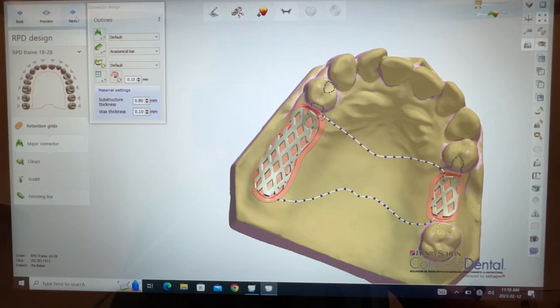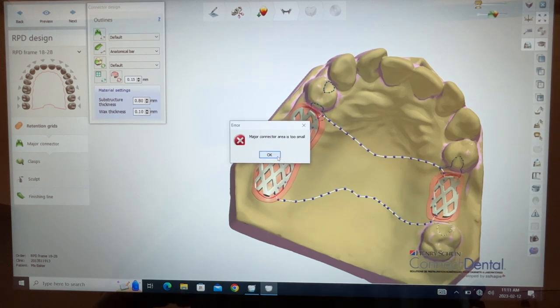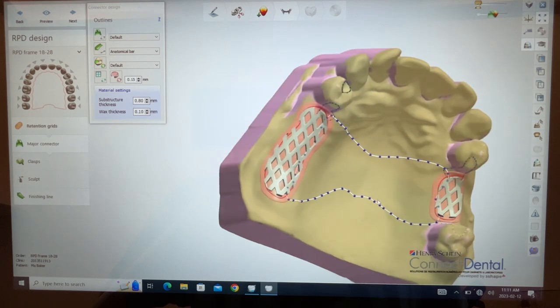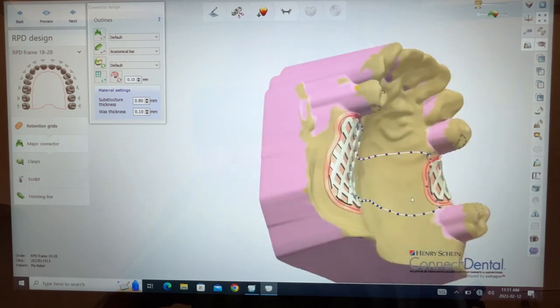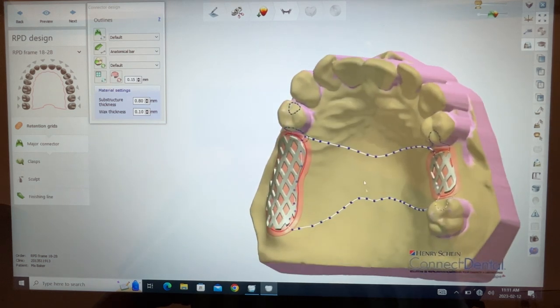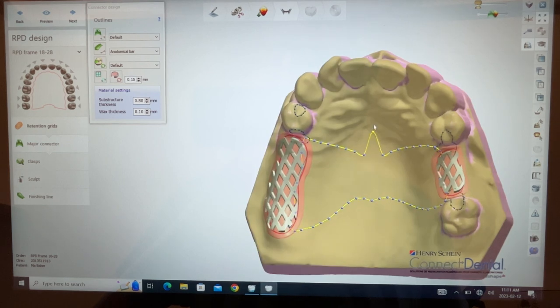It'll probably move on to the clasps. Major connector area is too small. Hmm.